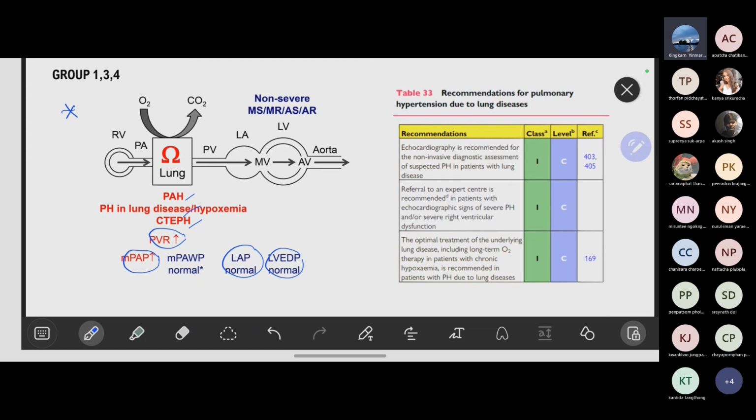This table lets you think about a patient with lung disease or COPD. The patient usually has a poor acoustic window because they have a problem with their lung and it's filled with air.